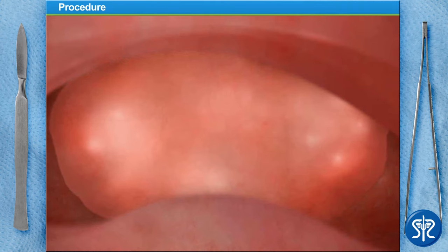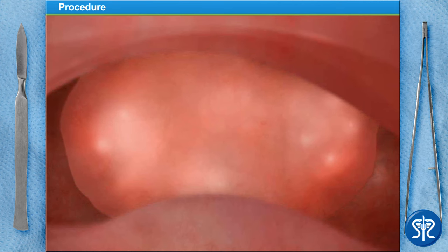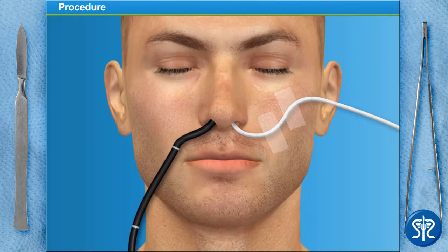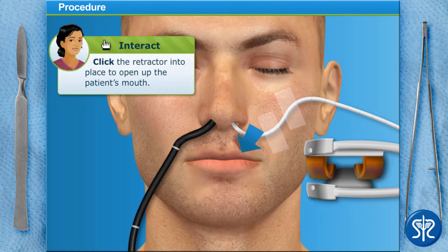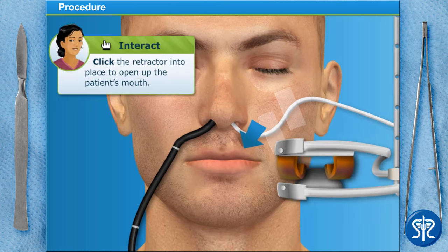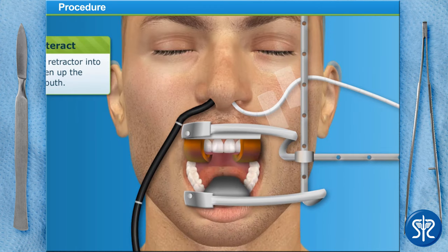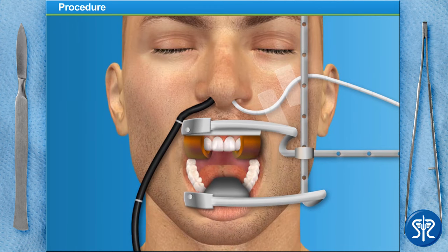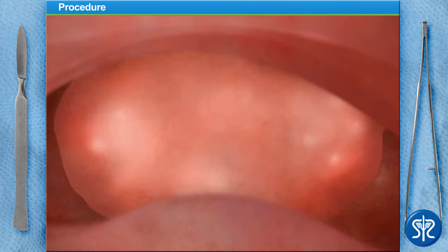We need to open the mouth and get the tongue out of the way so we can begin our procedure. To do that, we'll use a special retractor that opens the mouth, depresses the tongue, and locks into position.